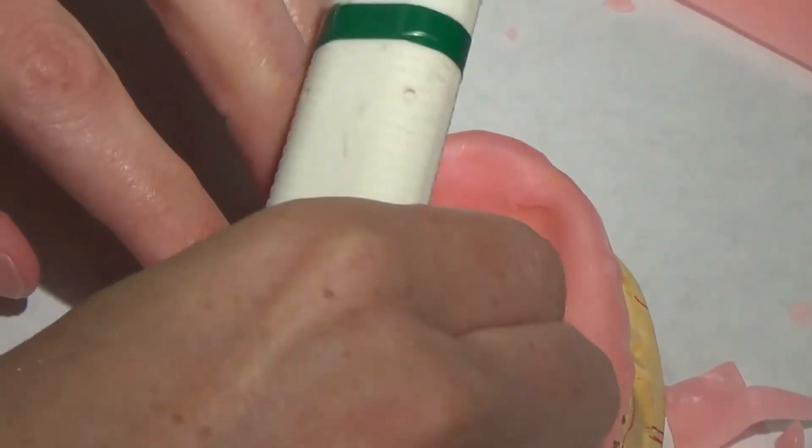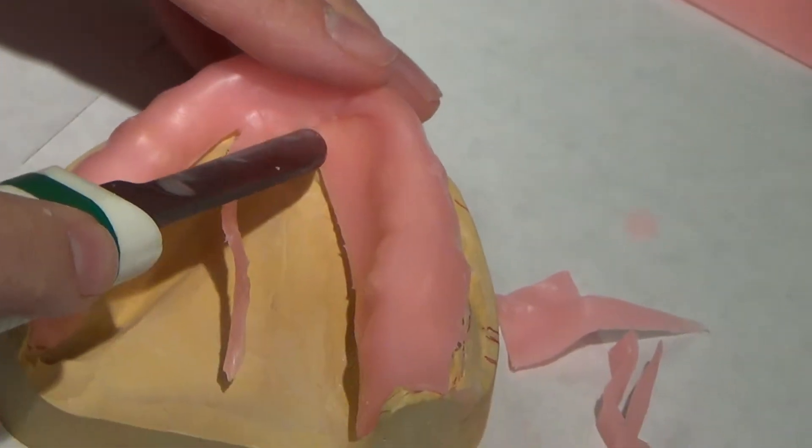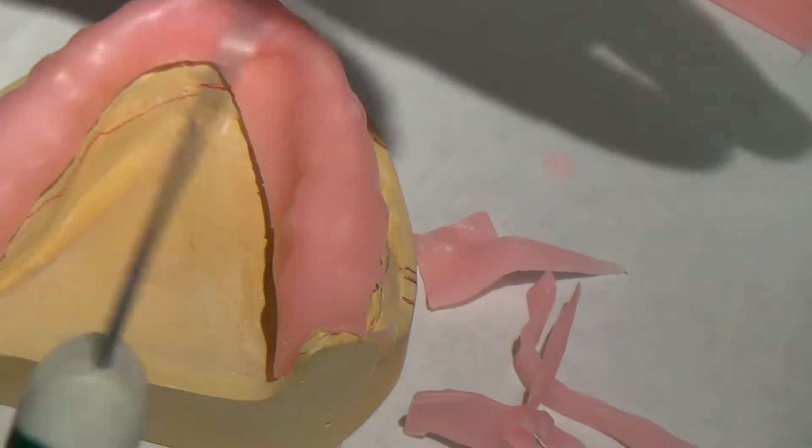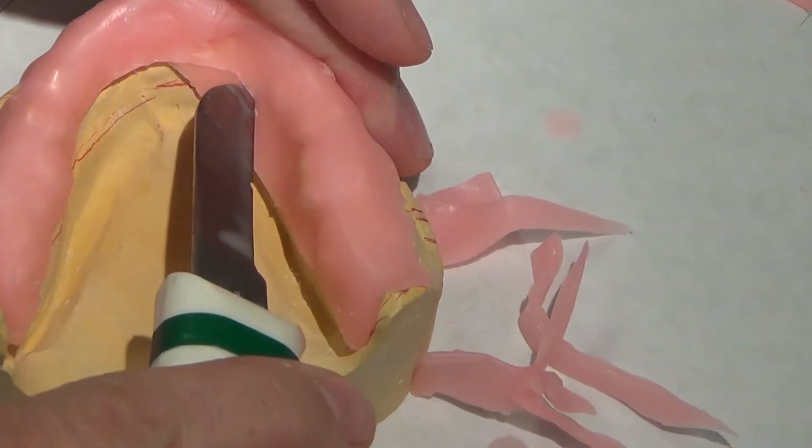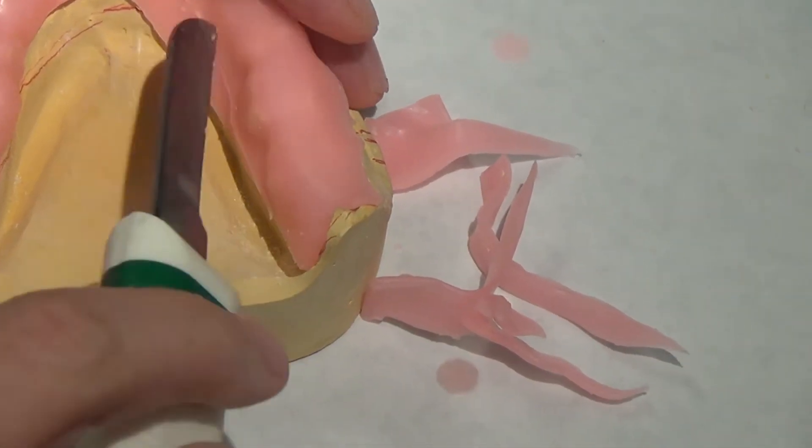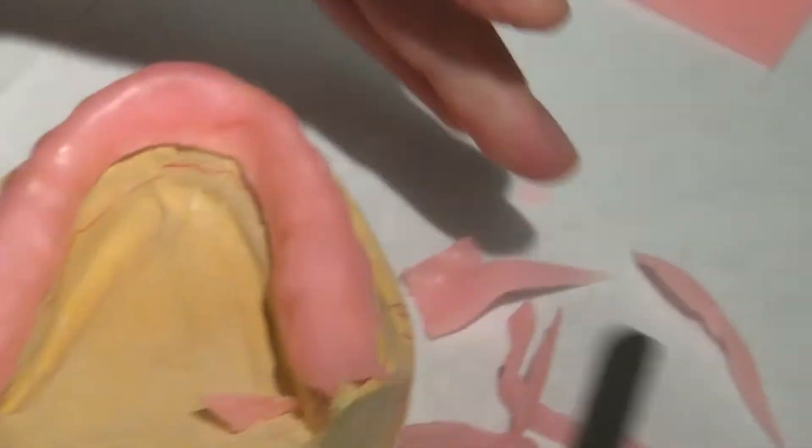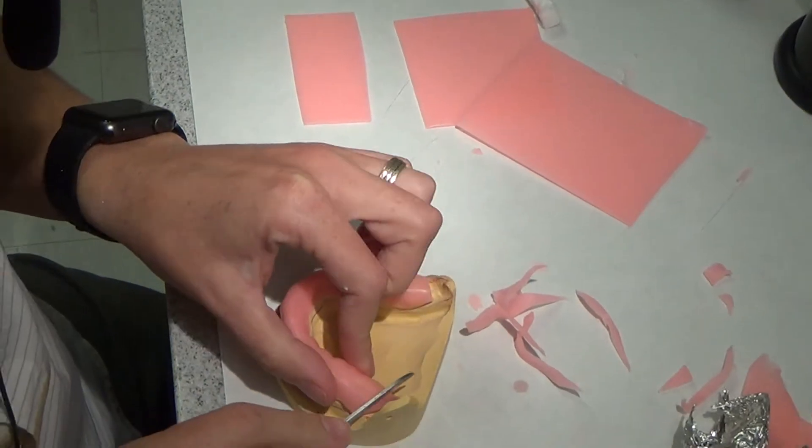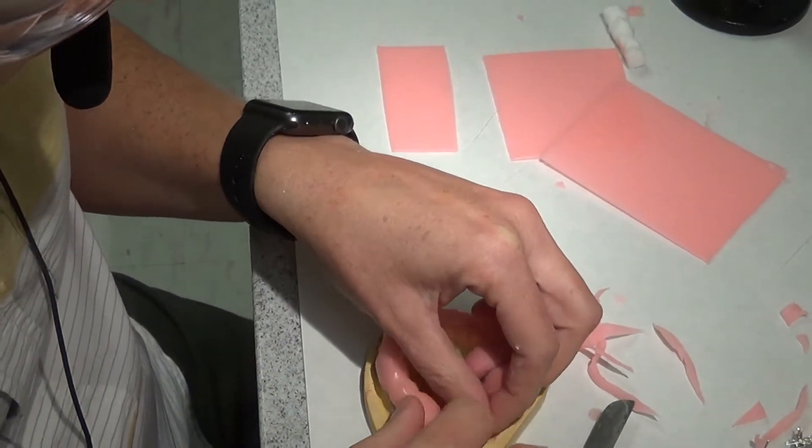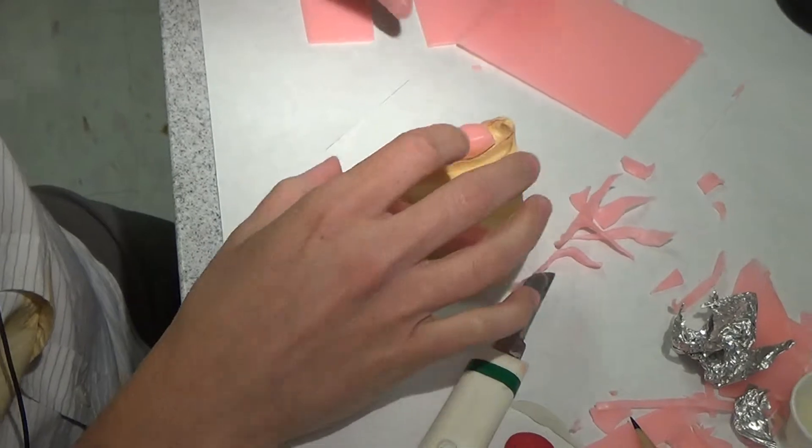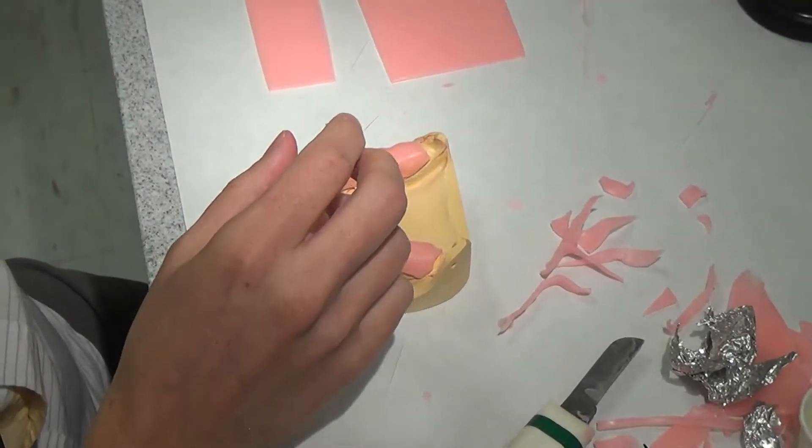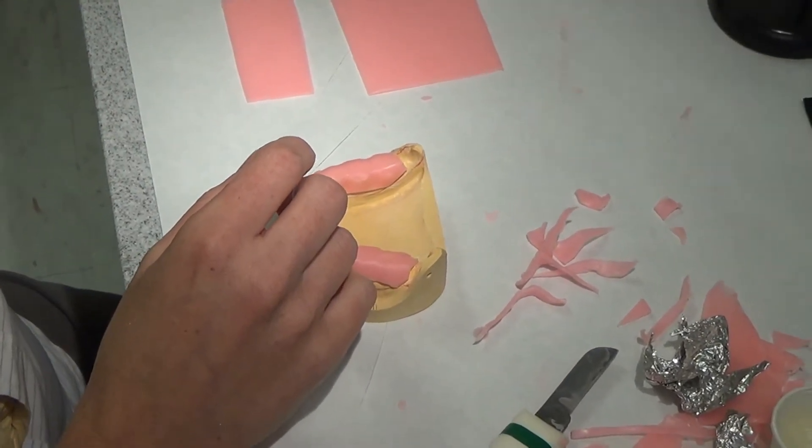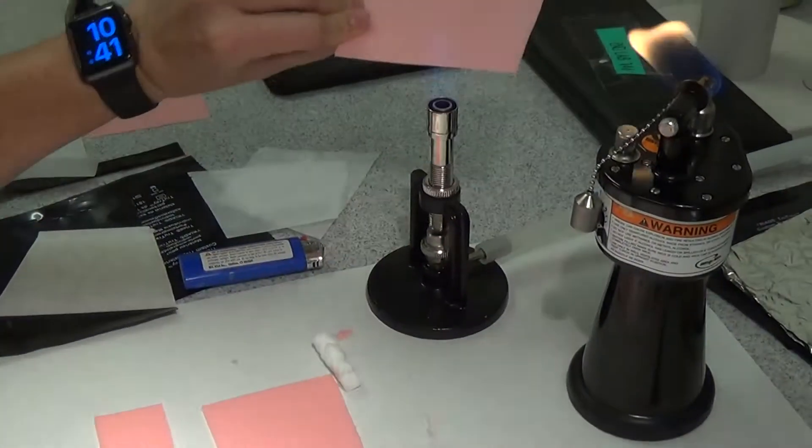And there are different ways to do this. Some people would put the whole layer on first and then come back and just add it over the teeth. You'll find that the more faculty you encounter while you're here, we all have our own ways of doing things. Doesn't mean they're wrong, just what works well for us. And you'll find what works well for you. It's the concept that you need to understand.